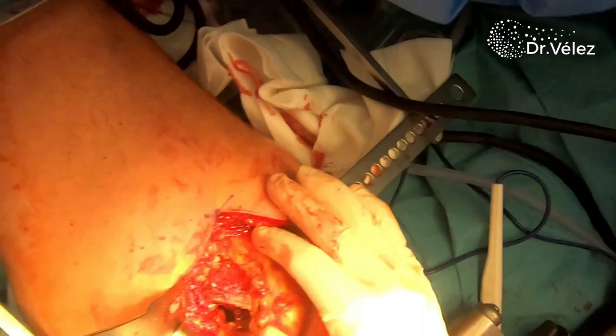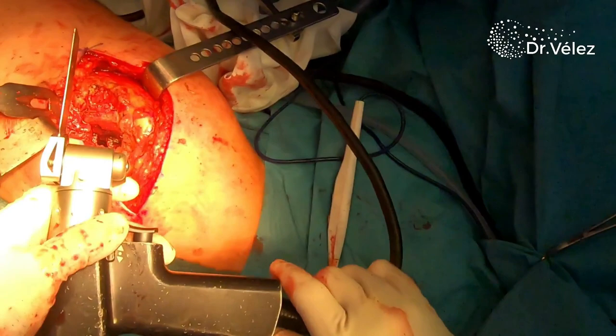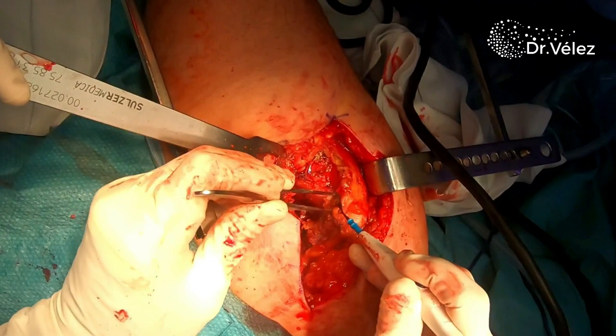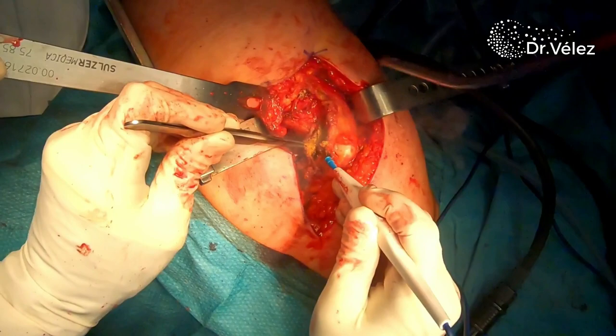And then with the osteotomy saw, we do first a cut in the femoral neck from the medial aspect to the lateral aspect, and then we complete the cut from just proximal to the greater trochanter, to the tip of the greater trochanter, joining the first osteotomy. The head and the partial neck are then removed, exposing the femoral canal.